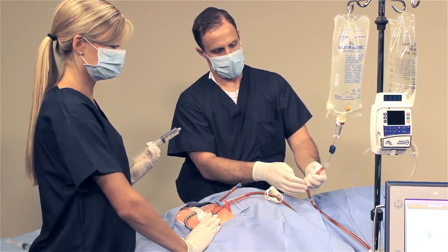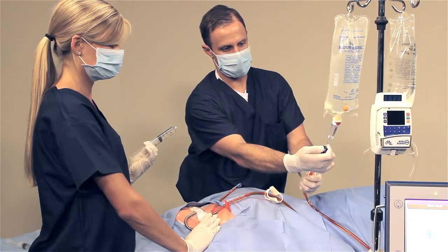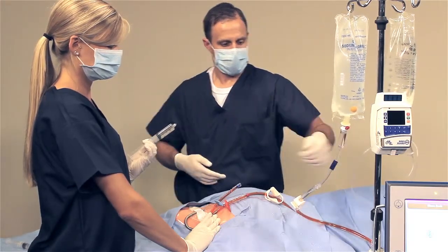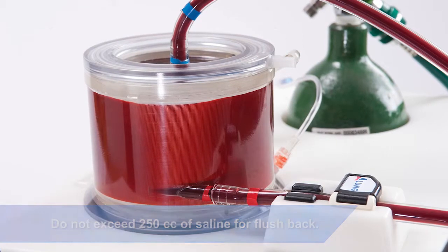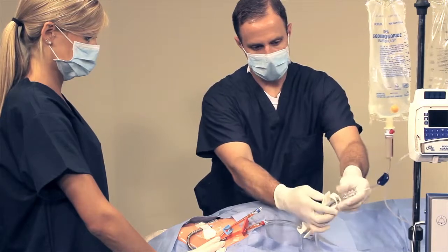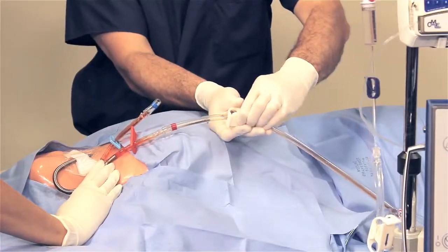Open the clamp on the blue tube and the blue clamp on the priming spike barb connector. Saline will begin to flow by gravity through the cartridge, rinsing the blood back to the patient. Once the blood is returned, close the clamp on the blue tube and the priming spike barb connector. Clamp the red tubing.